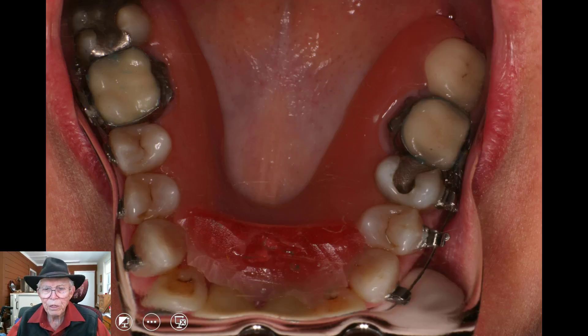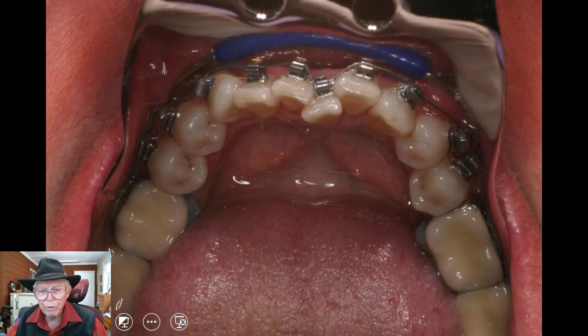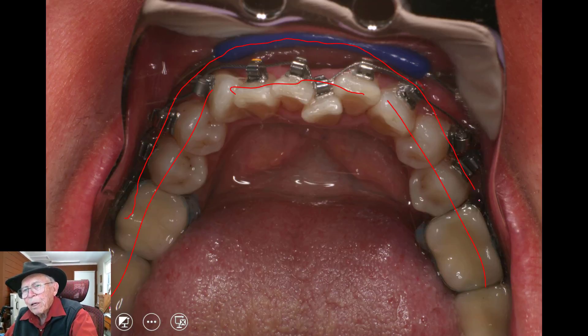During the case we used a bite plate up here in the anterior part of the mouth to open that up. That's where the lower anteriors would bite up in this area right here, and this is the upper arch when we started. You can see the difference of it when we get there. The lower arch is lining up like this across here, and we're going to expand this and bring this whole thing out.